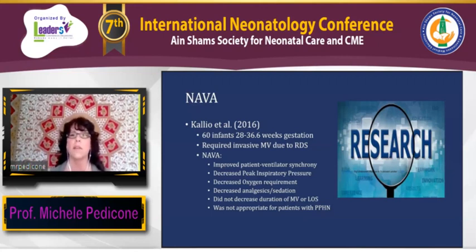So we are finding that although we enjoy using NAVA, in fact, at the University of Washington right now, there are 5 patients, I just checked yesterday, on this modality using NAVA. However, they have found it's more appropriate for patients with respiratory distress and also for the BPD patients, but not necessarily for those patients who are suffering from persistent pulmonary hypertension.